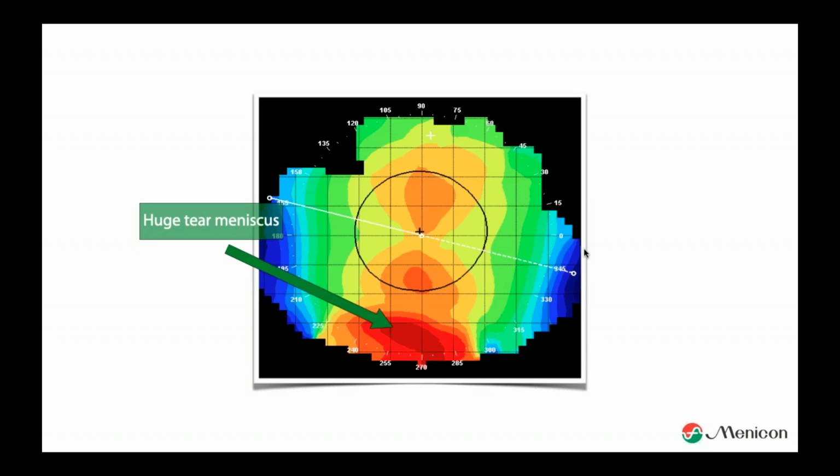So it is important that we remind the patient to blink. You have to learn to talk with your patient during the measurement. Say, okay, blink a couple of times. Okay, stop blinking so I can do the measurement, and blink again, and you will see that you end up with much better topographer maps. That's for sure.